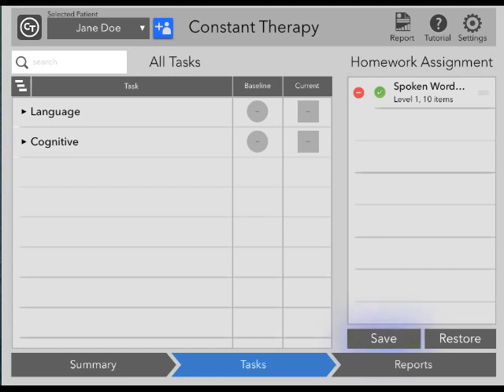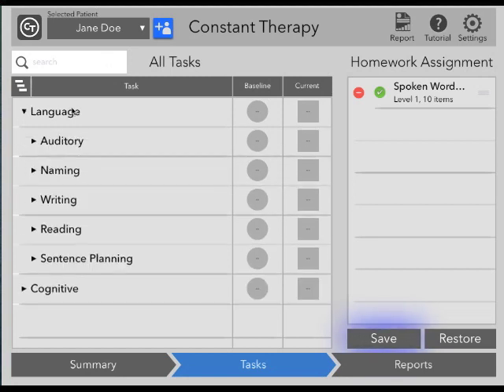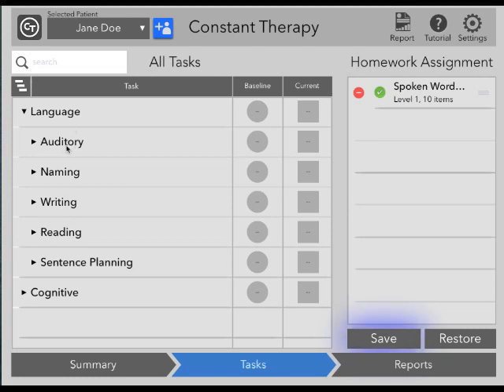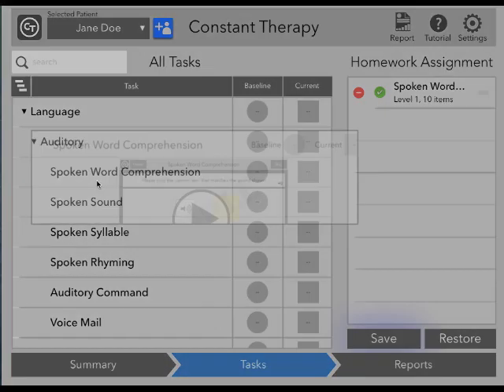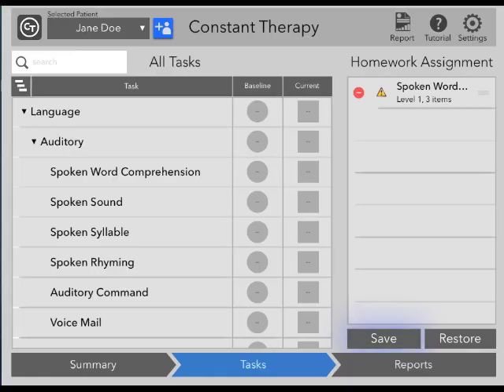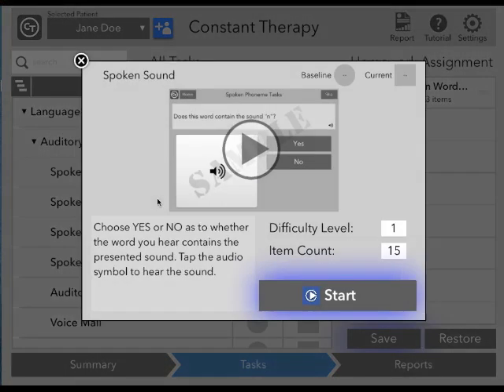To identify a task for a patient, let's review the tasks available to us. On the left-hand side of the screen is our task list. You can see that we have two types of tasks: language and cognitive. We can drill down by tapping on these tasks and seeing other categories. Once we don't see any more arrows, we know that we're at the task itself. When you are ready to assess a patient on a task, simply tap on that task. You'll see a pop-up with instructions for how to complete the task. You can also tap on the picture for a video of the task with instructions.